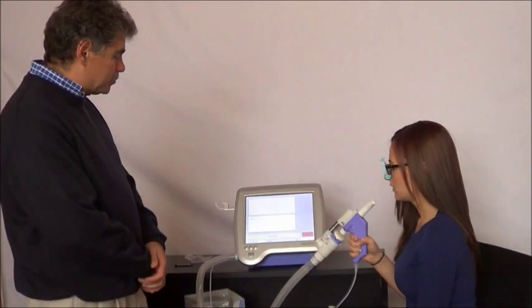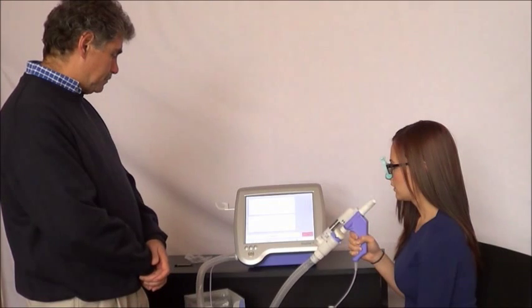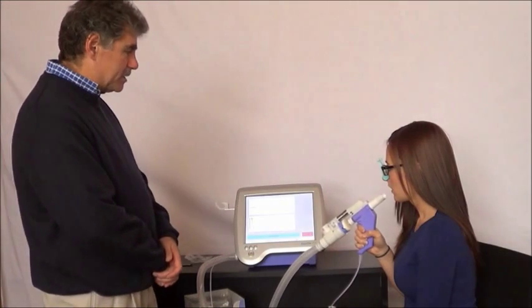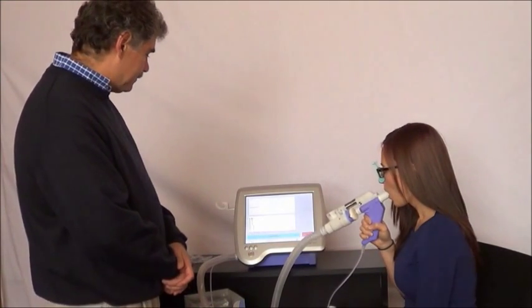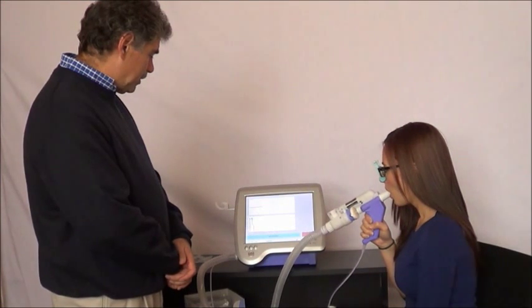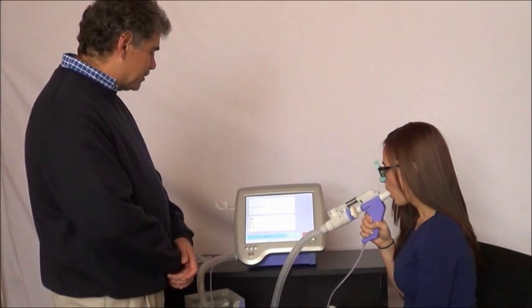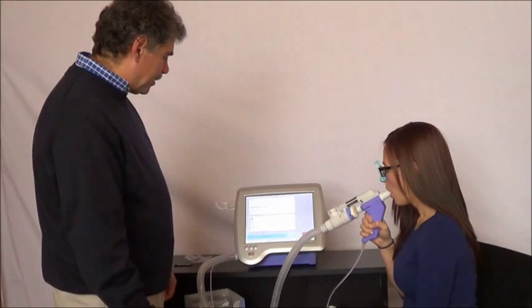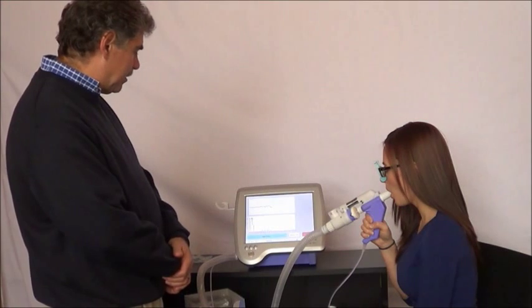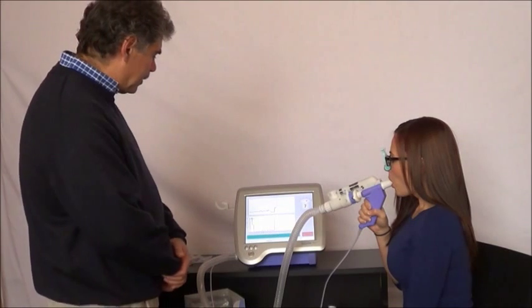The next message will be 'Tidal Breathing' again. So Bianca is going to breathe normally for a few cycles. Whenever you're ready, you can start exhaling. It's very important that you completely empty your lungs — exhale, exhale, push, push. Then a big inhale, big inhale, and hold. Very good.